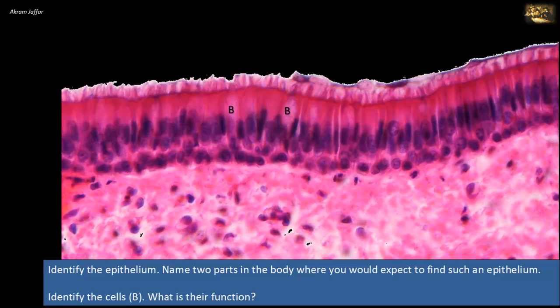This is a type of epithelium that, though comprising only a single layer of cells, has its cell nuclei positioned in a manner suggestive of stratified epithelia. So it is a pseudo-stratified epithelium. The term pseudo-stratified is derived from the appearance of this epithelium in section, which conveys the false, that's to say pseudo means almost or approaching, impression that there is more than one layer of cells, when in fact this is a true simple epithelium since all the cells rest on the basal lamina.